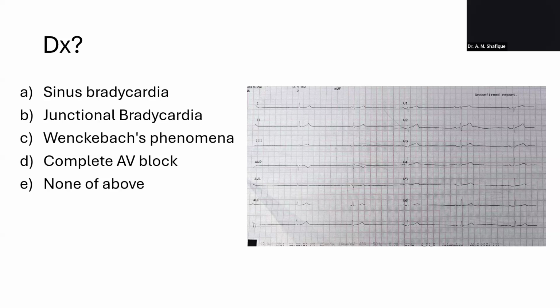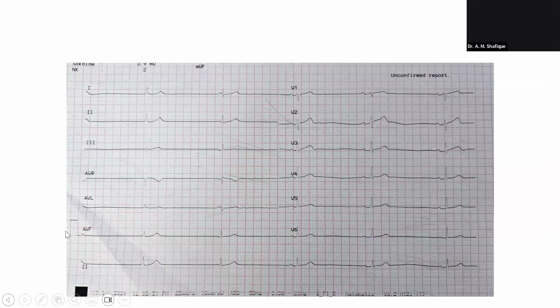If I go back to the previous slide, look here again. I think its heart rate is very regular, the ventricular rate, and it is a sinus bradycardia. So can I get some comments from my teachers?